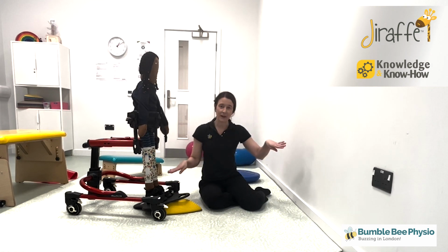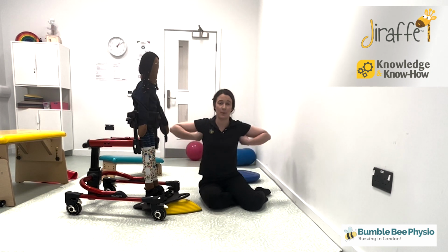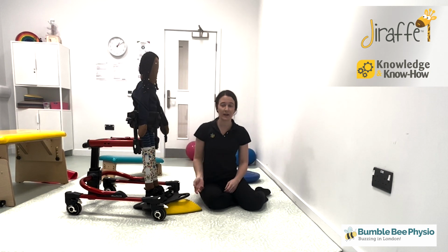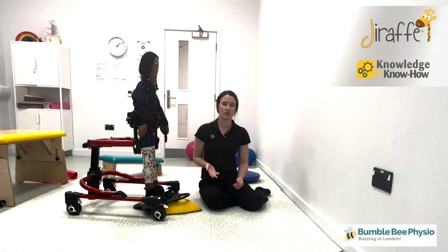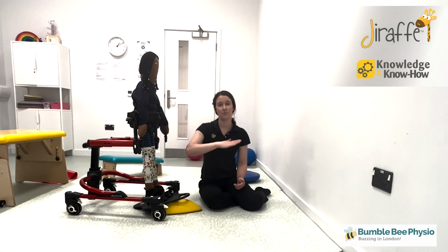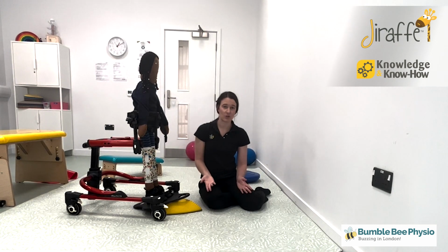You can tilt a therapy bench to have it on a wedge, especially if your walker is taller, because it's used to support them all the way up to their arms while they're doing walking. You can also use a book. I've stacked a hardback book up onto an object before, but whatever you use, just try to make sure it's measurable, because you want to maintain or sustain the current angle that you've got, and then maybe over time you might want to increase it, or maybe through a growth spurt where your child becomes tighter, you might want to reduce it. So whatever you use, just try to measure it. You can even measure it with a goniometer if it's something that's not really very measurable.